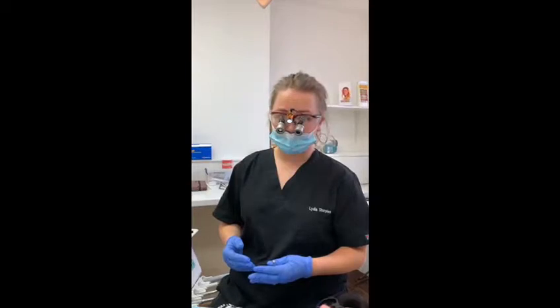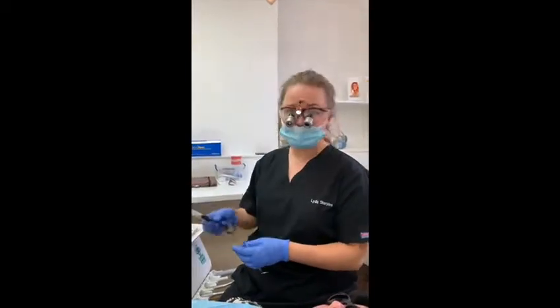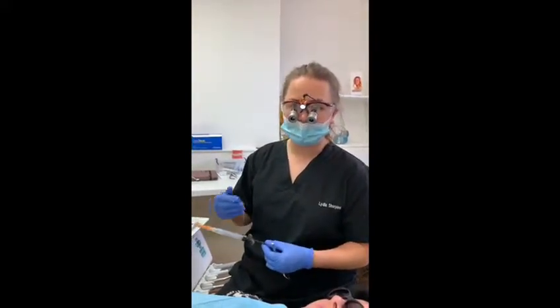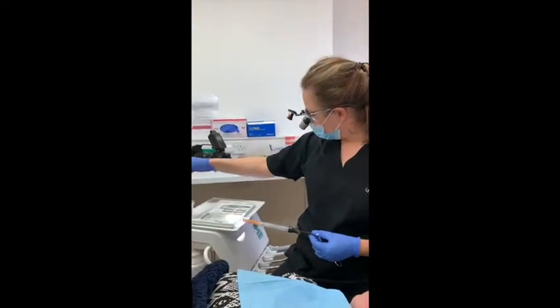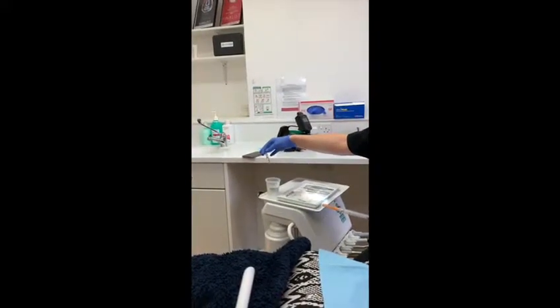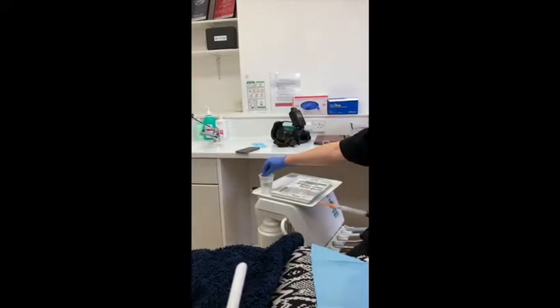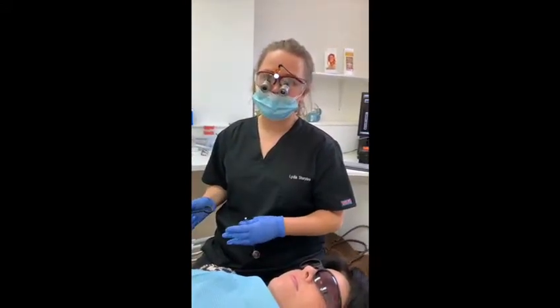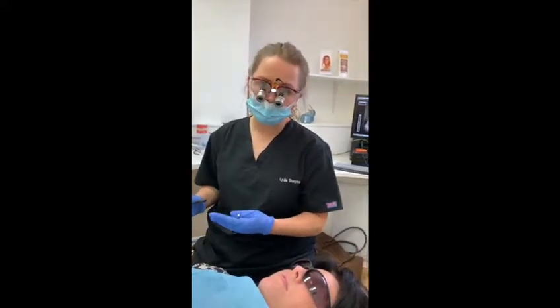Amy now has some superficial numbness from the numbing gel we've placed on her gum and we're ready to place our dental anaesthetic. There are some top tips that we always do here at Bespoke to make sure your anaesthetic is as comfortable and pain-free as possible. The first thing we do is warm up the anaesthetic cartridge in some lukewarm water so that when we administer it, it's closer to your body temperature, which makes it much more comfortable. The other thing we do is make sure we go really nice and slowly, because the slower we do the anaesthetic, the more comfortable it is for you.